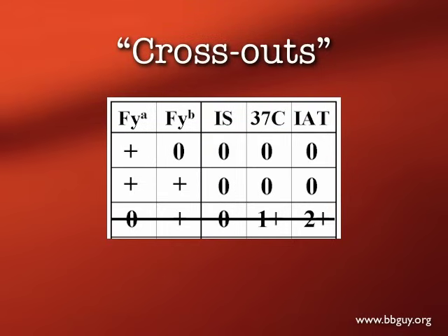Okay, so let's look at cell 1 here, which is the first of those two completely negative reactions. Let's look at cell 1, no reaction whatsoever. We have what we assume to be a double dose of FYA antigen. Again, we talked about the caveat before. It may not be, but we're going to assume that it is. And as a result, since the antigen is present, it's a double dose, and there's no reaction, we're going to put a single slash through the FYA antigen up at the top of the panel.